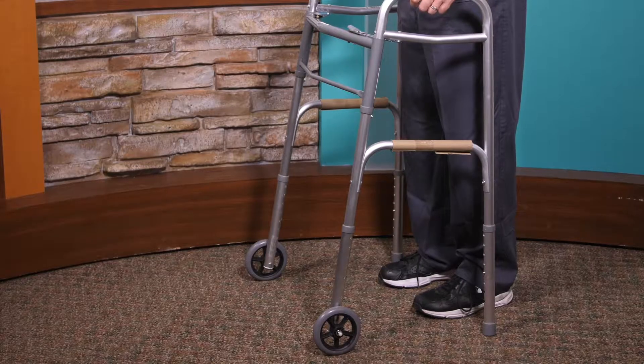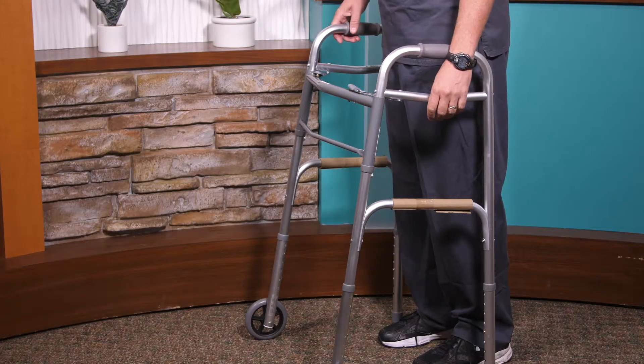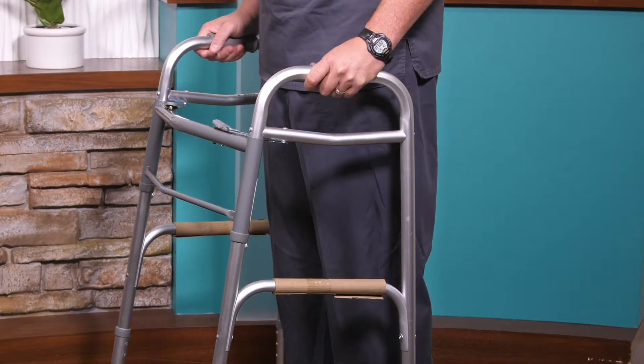I've got everything locked in place and now I want to make sure that the height is adjusted right. The walker is probably about eight inches in front of me. When I place my hands down at my side, what I want to see is the walker hitting the crease of my wrist right here. This walker actually looks pretty good, so I would actually be ready to walk.